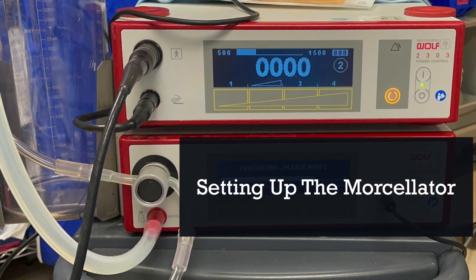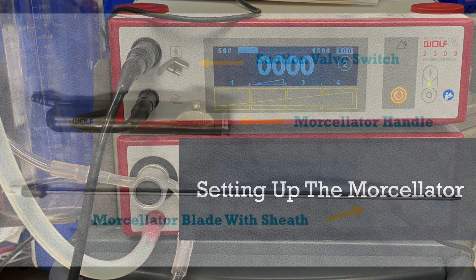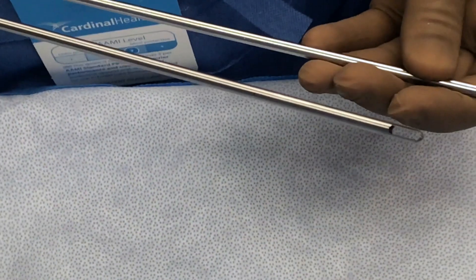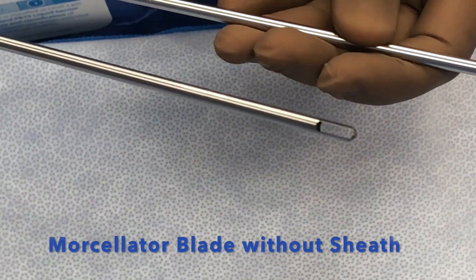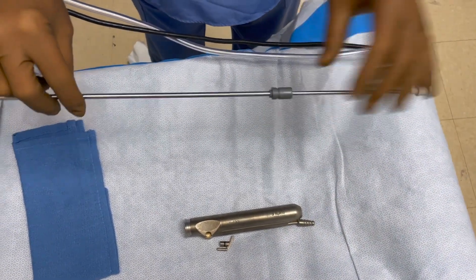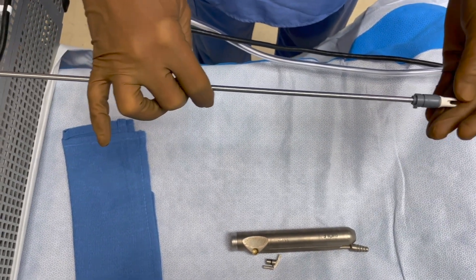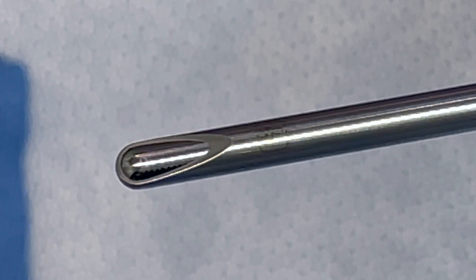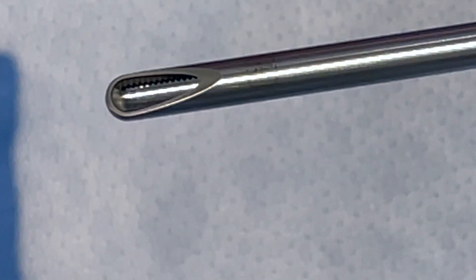Prior to morcellating, you should be familiar with the device and its setup. There are three main pieces to the morcellator: the handle, the suction valve switch, and the morcellator blade itself. We set up the blade so that only one-third of the aperture is visible when the blade is not spinning, as seen in this video. When the aperture is open larger, it will create larger fragments of tissue that risk clogging the device.